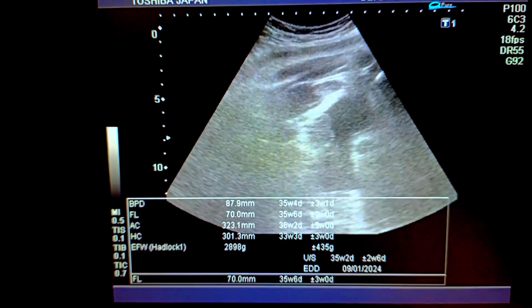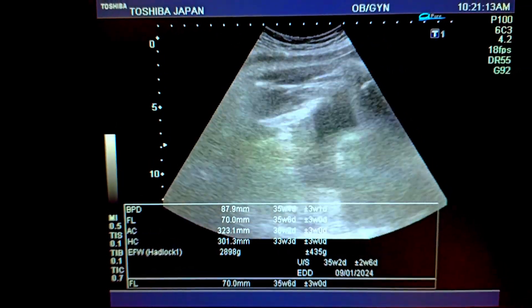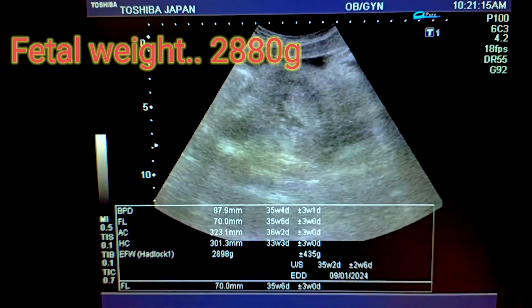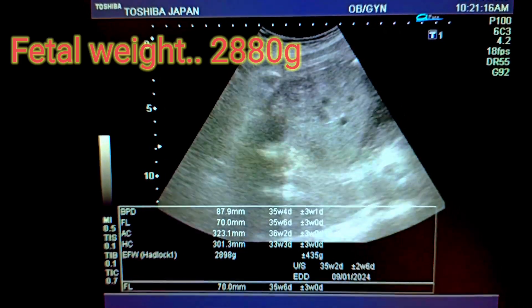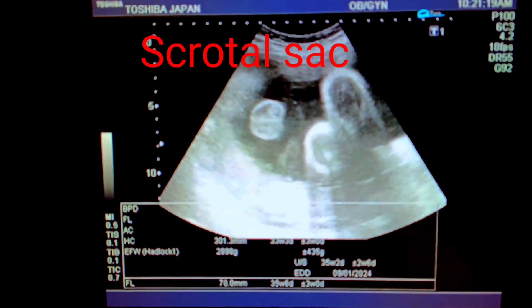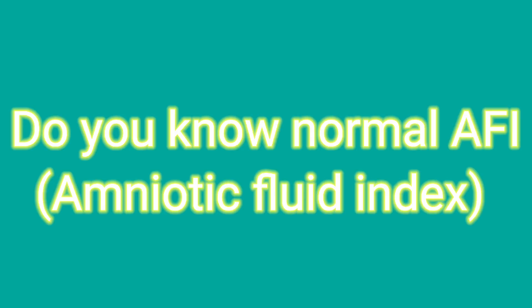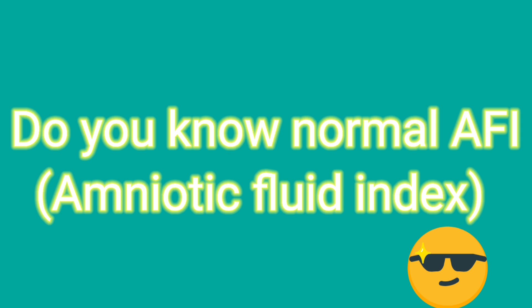The fetal weight is about 2,880 grams, and the fetal weight corresponds to a fetal age of about 35 to 36 weeks of pregnancy. See this scrotal sac. Do you know the AFI — amniotic fluid index — and what is the importance of this index? I will tell you.